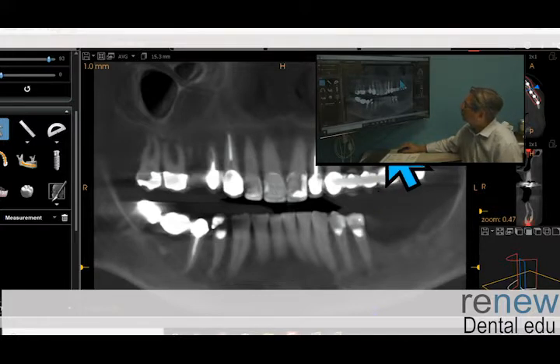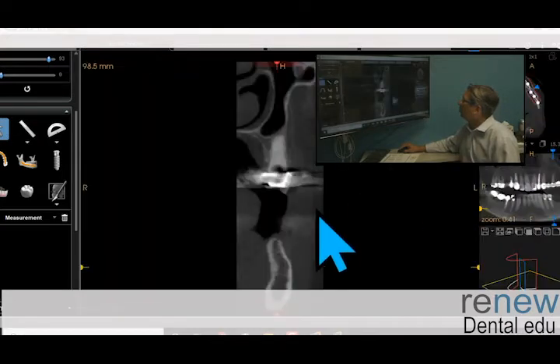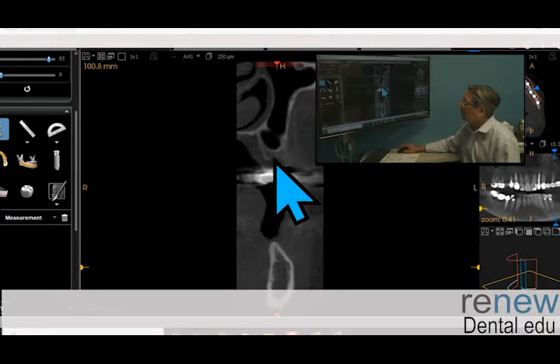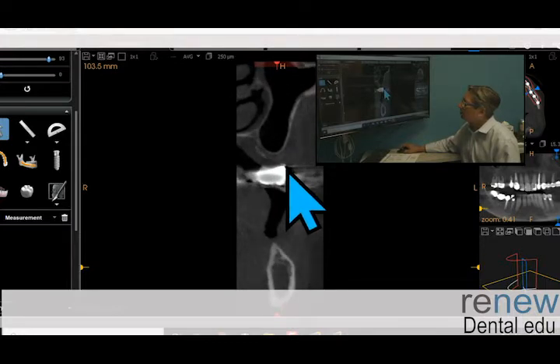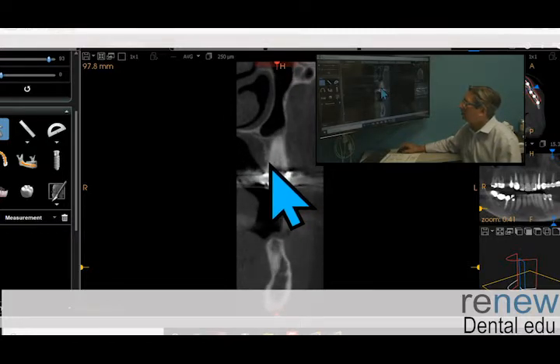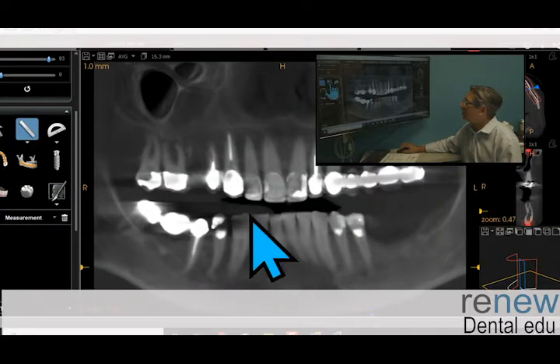There's a septum here, right here, bone, and then it just drops down into that first molar area here. So as you go back, more distal across the root, it becomes nothing. See, your bone becomes very nothing. So very difficult to deal with this area, but we have no 19, so we don't have to worry about that area, right? So we're only looking at a premolar occlusion.